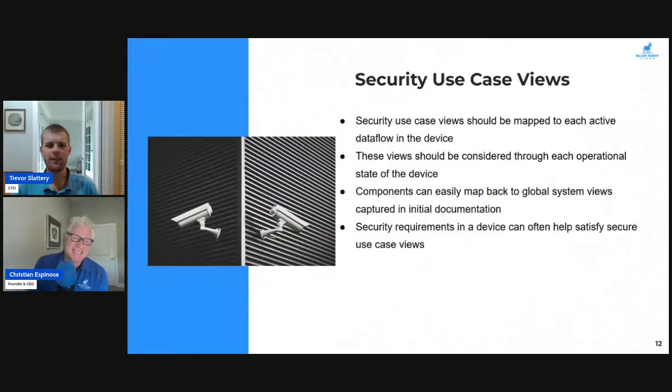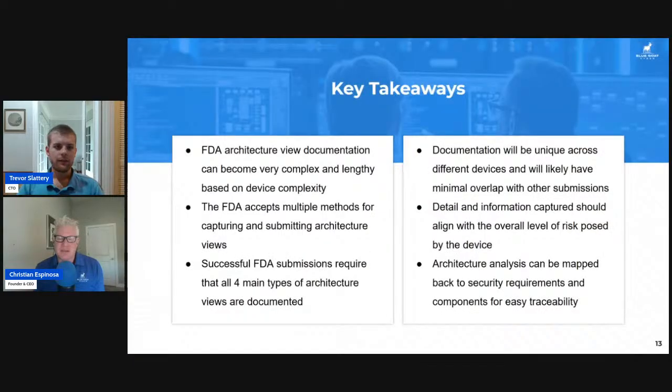Like, we can go back to the updatability and patchability considerations. True. Our device should verify the update package pushed out by our update infrastructure. We control every component. We control the data flow. We still need to verify that it's secure. So in that case, we may need to make sure that that patch is digitally signed with our certificate. Exactly. That's a great example of how we can make sure that something is secure through a data flow transfer. I guess that's true. We don't even trust ourselves, do we? Exactly. Zero trust applies to us as well.